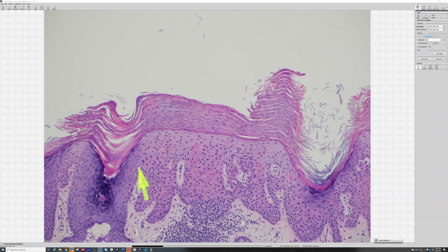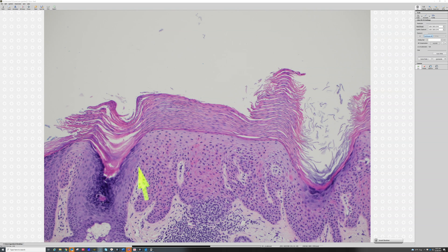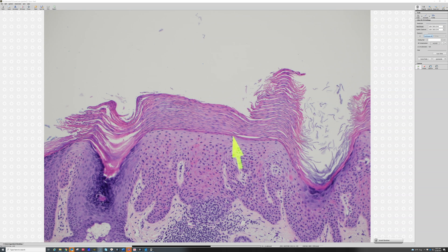You can see this whether it's actinic keratosis, squamous cell carcinoma in situ, or even reactive or inflammatory things like psoriasis, where the epidermis grows too quickly. In psoriasis, keratinocytes go from the basal layer to the top in about 7 to 10 days, which is not enough time for a granular layer to develop, so you get parakeratosis and loss of the granular layer.